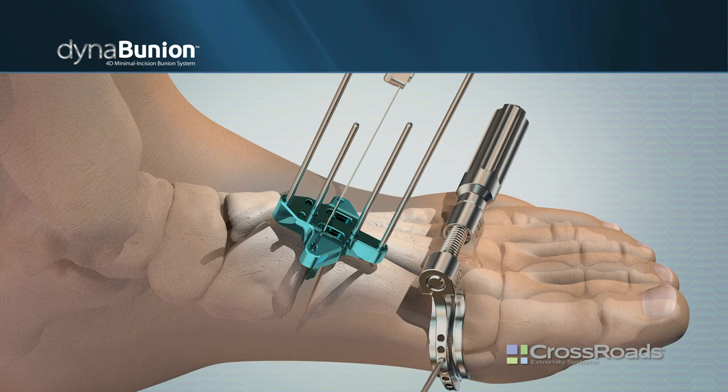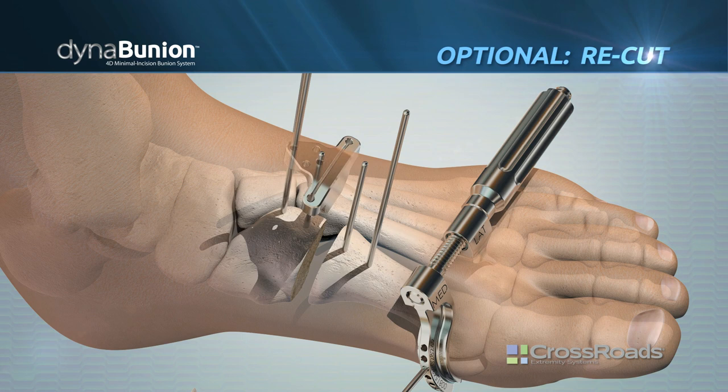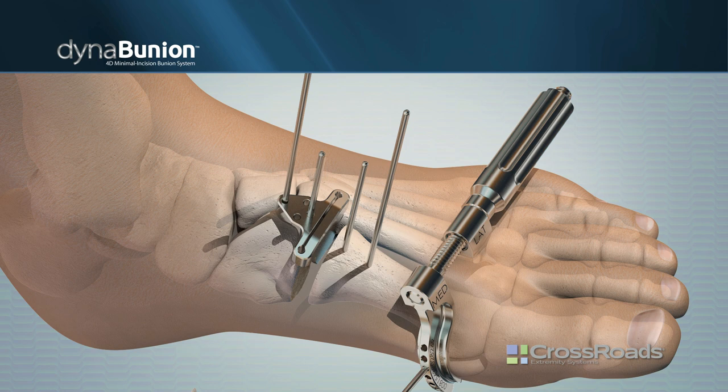Once the cut is complete, remove the cut guide while leaving only the four wires and the distal reducer in place. Remove the cuneiform resection. If additional bone needs to be removed, a recut of either joint surface can be performed. Perform any additional desired joint preparation.